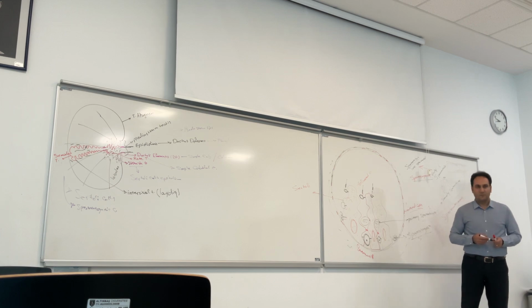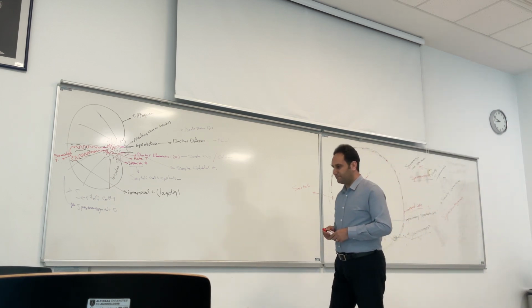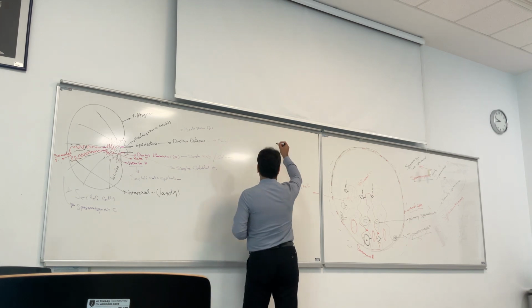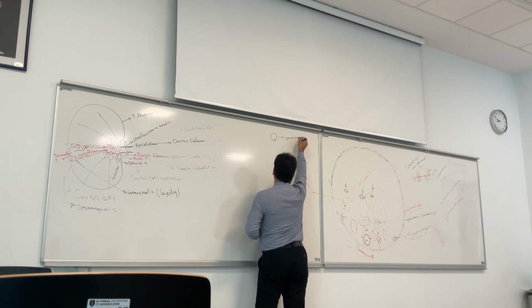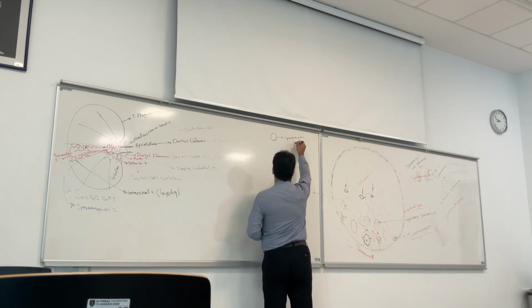We have a special division in the spermatogenesis stage. This is our spermatogonia, or stem spermatogonia.